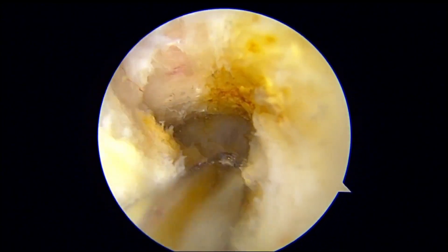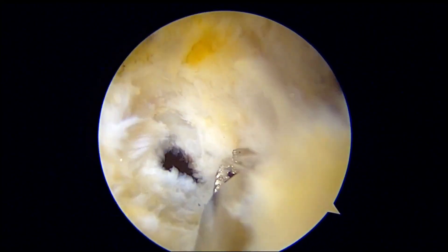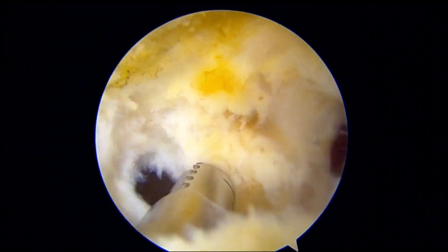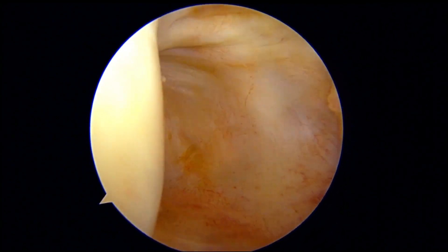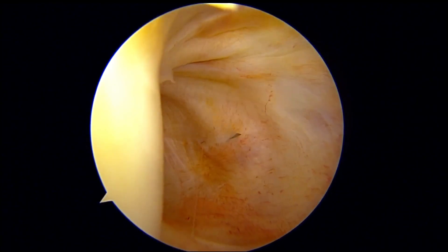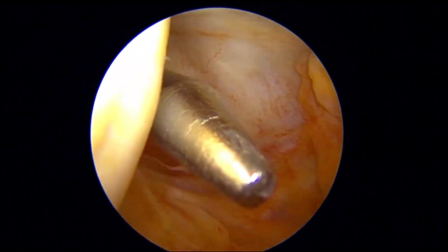The shaver was then used to clean the intercruciate septum, followed by accessing the posteromedial and posterolateral windows. The appearance of these two posterior compartment windows is referred to as 'bat eyes.' The camera was then directed towards the posteromedial space to create the posteromedial portal. Transillumination technique could visualize the superficial medial structures, primarily the saphenous vein, ensuring that the portal created avoids these structures.